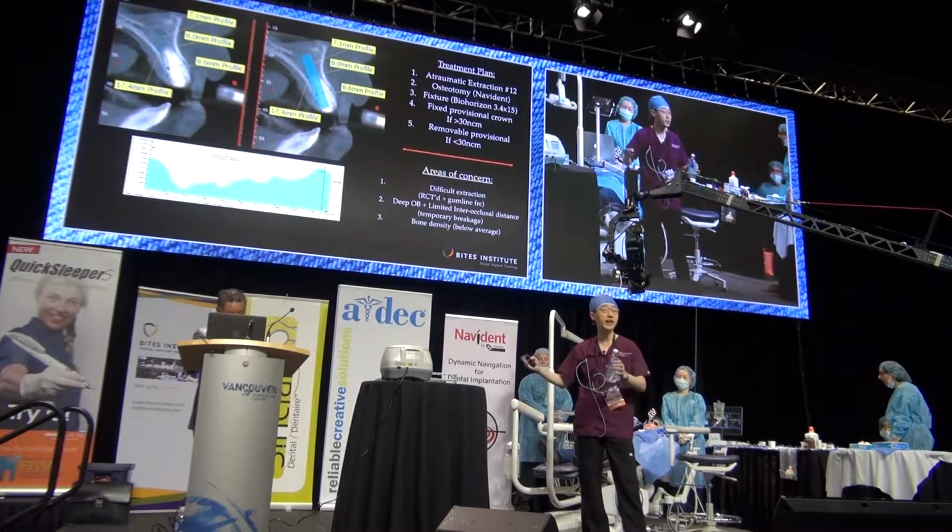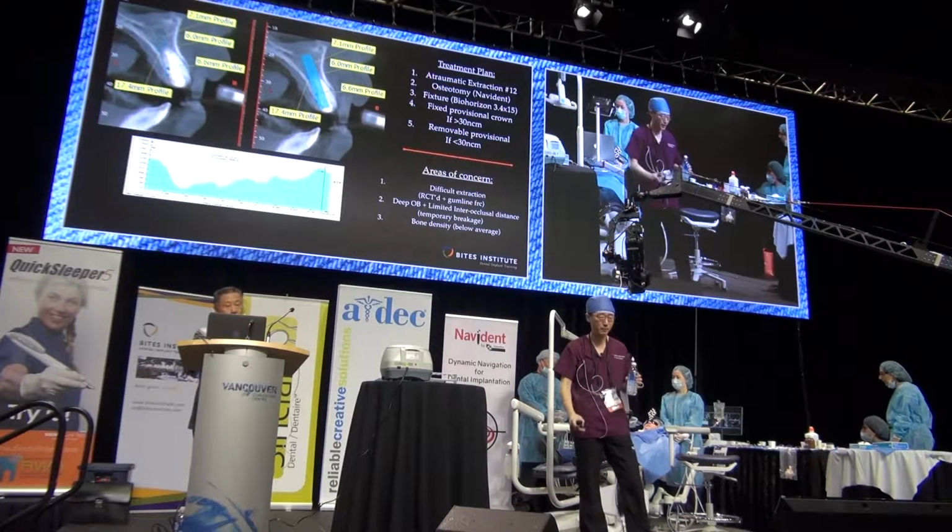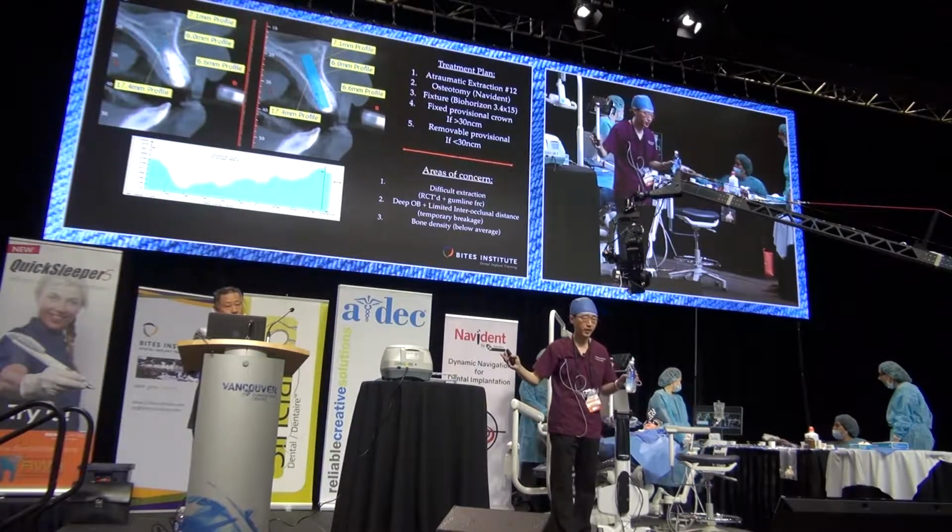So we don't know until we get it. It's one of those situations. But whenever you're doing anterior cases, always have a backup, okay? Always have a backup. Areas of concern, okay?